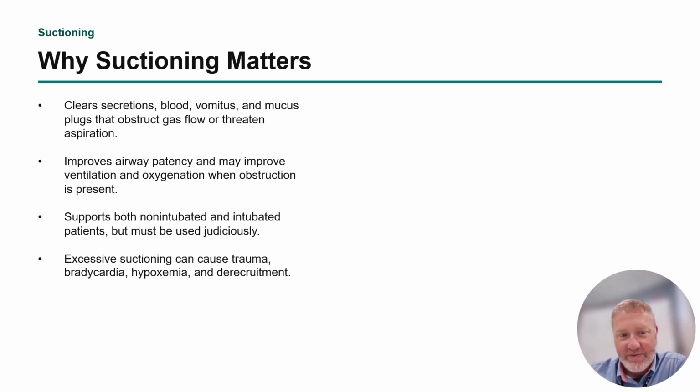So you've got to be careful not to oversuction. Trends in the last 5 to 10 years: we never routinely suction anybody, and we only suction as little as necessary to help the patient in that moment.